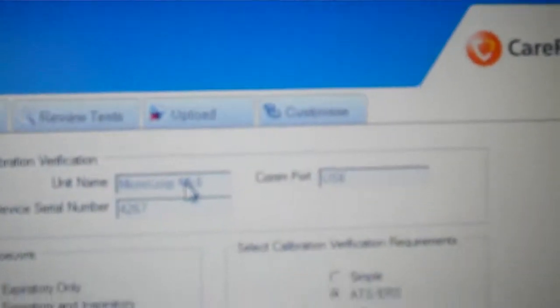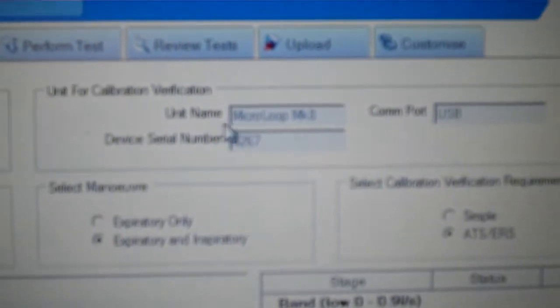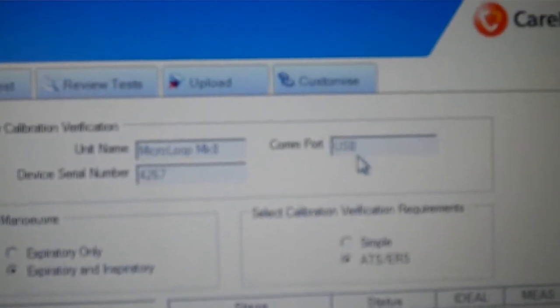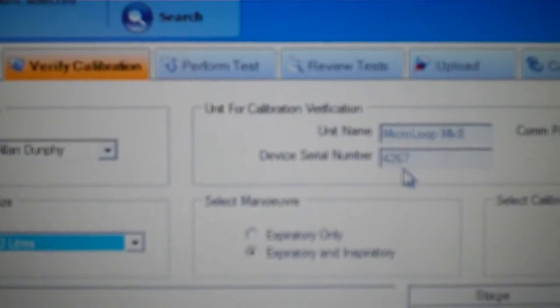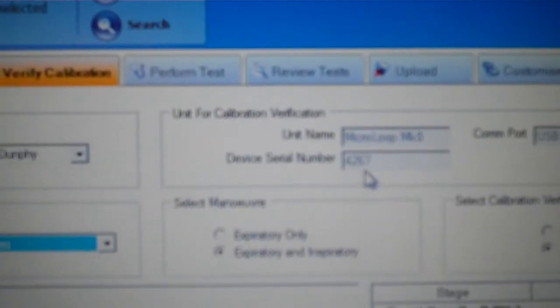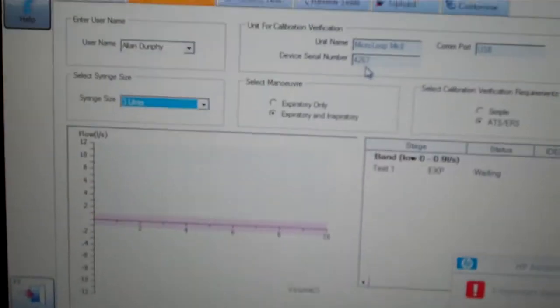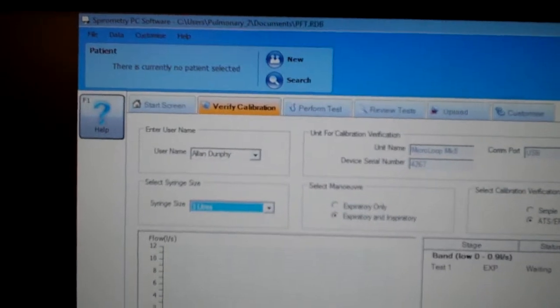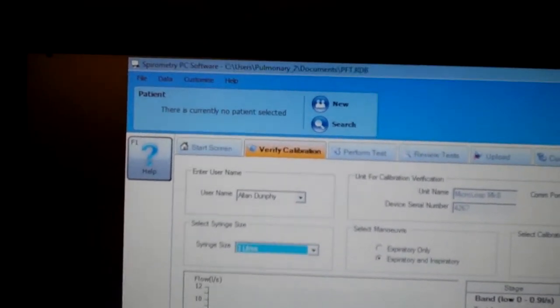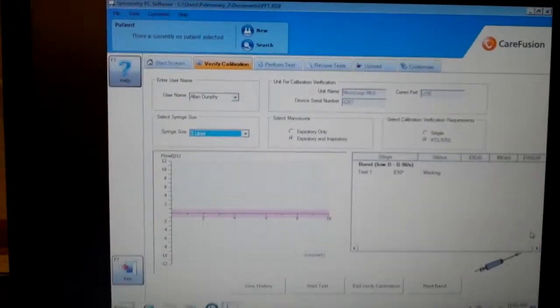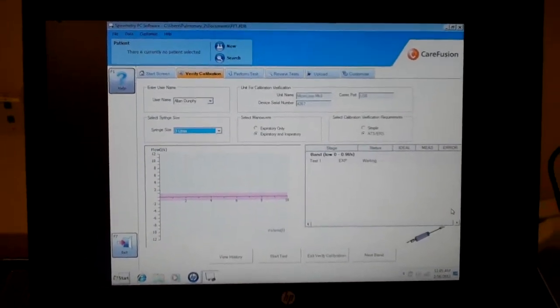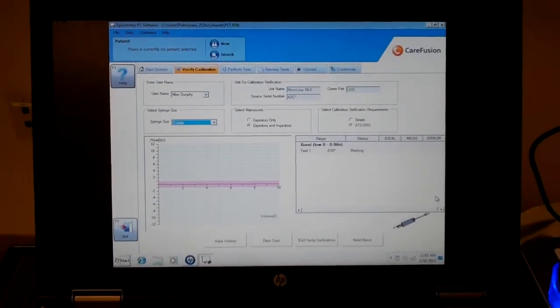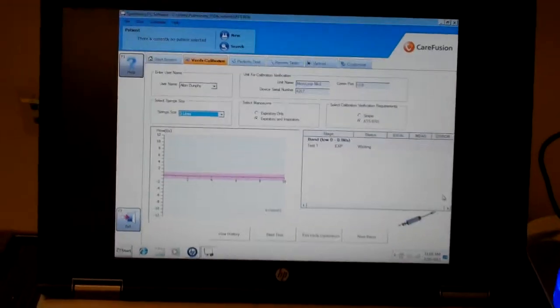You will notice that we are using the microloop unit name. It is a USB port and it has a device serial number. This device is a turbine type flow sensor, which according to the company does not require calibration, but according to ATS guidelines, it is required at least once a day.